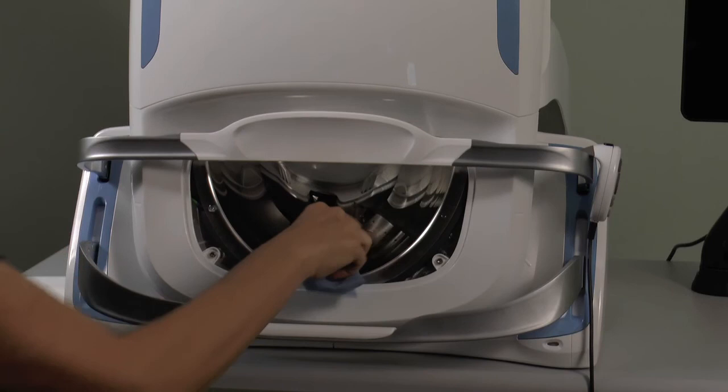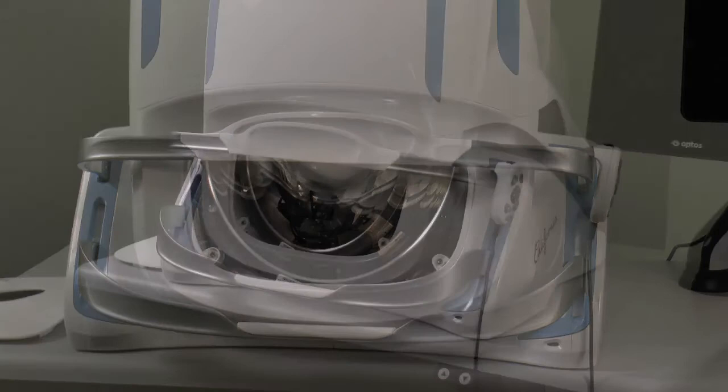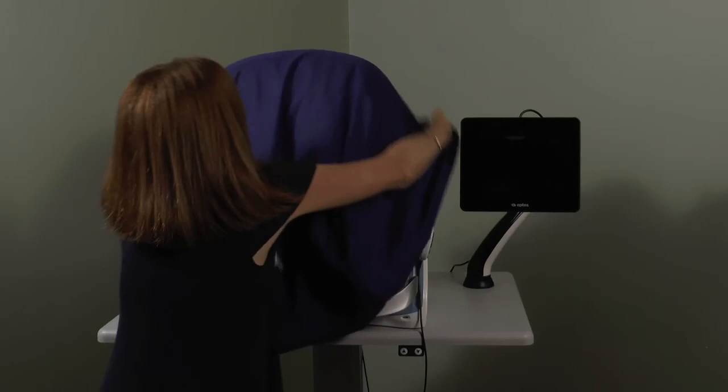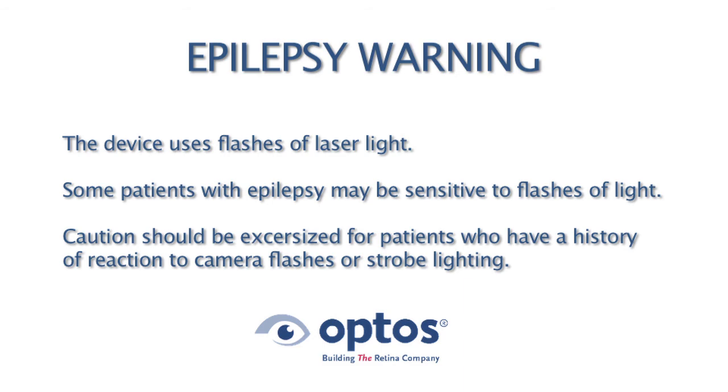Now snap the face pad back in place and put the dust cover over the device. Here is some guidance for use on patients with epilepsy. The device uses flashes of laser light, and some patients with epilepsy may be sensitive to flashes of light. Caution should be exercised for patients who have a history of reaction to camera flashes or strobe lighting.